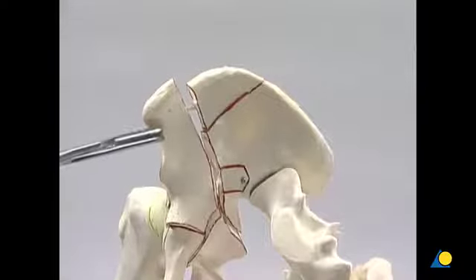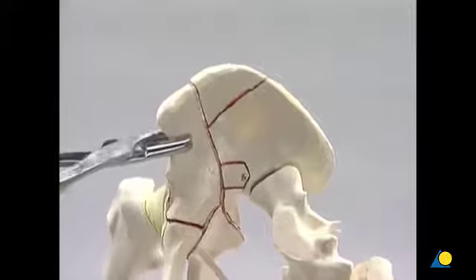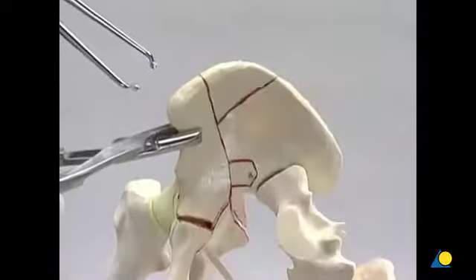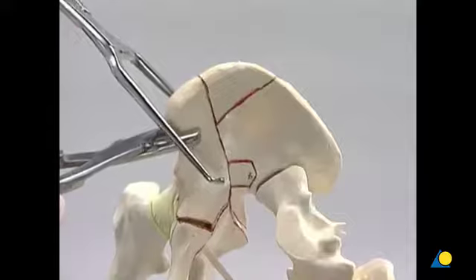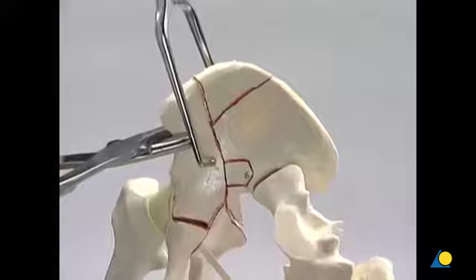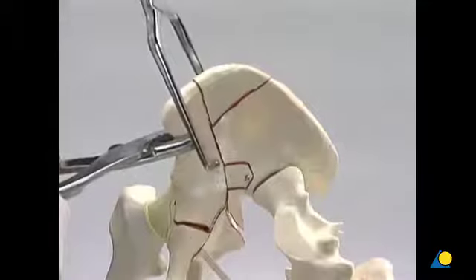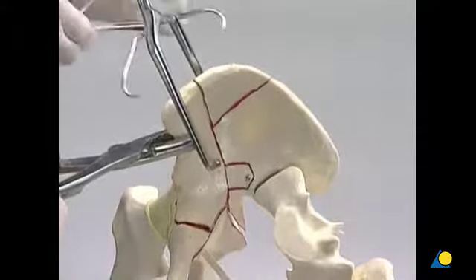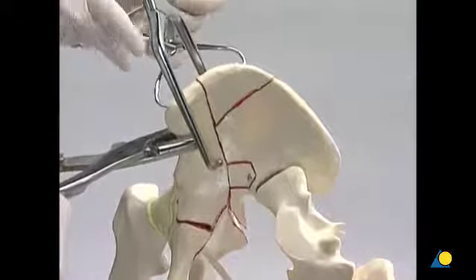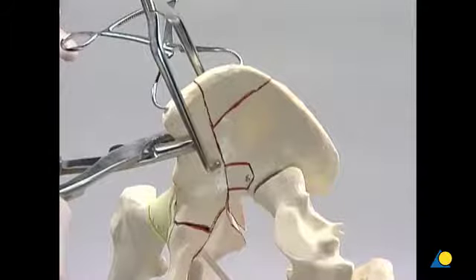Now the concavity of the iliac fossa must be restored. The iliac wing is rotated internally using a Farabeuf clamp. The large pelvic reduction forceps is positioned around the anterior column and the repaired portion of the iliac wing to provide additional reduction across the oblique fracture line. Care is taken not to inadvertently open the fracture on the opposite side. The pointed reduction forceps is used to maintain anatomical reduction across the superior fracture line of the anterior column.